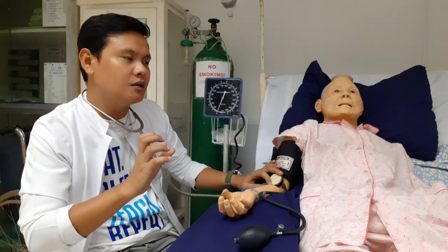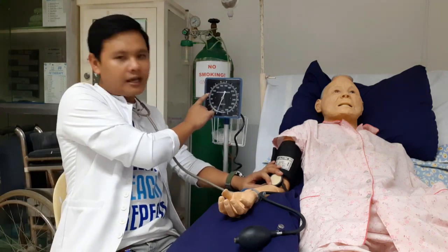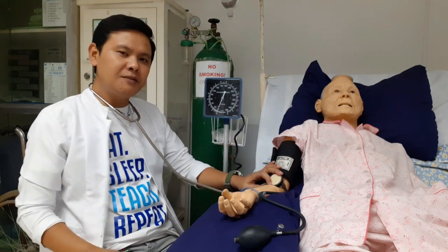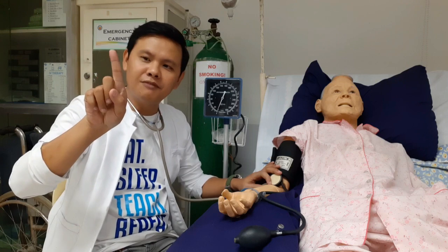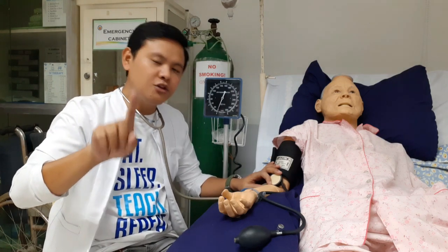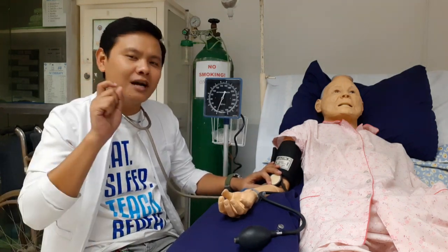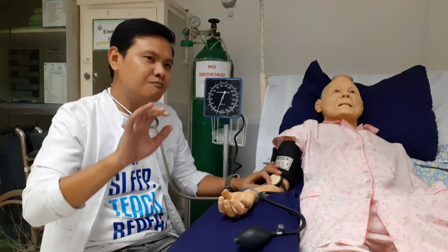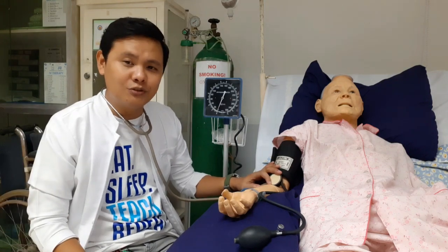Tapos, yung lowest sound, yung pinakamahinang sound, okay, ay narinig ko around 80. So, ang BP ng pasyente ko is 130 over 80. Tandaan natin, yung malakas na sound or usually the third fluctuation, kasi makikita mo, magpa-fluctuate yan. 1, 2, 3. Sa may pangatlo, doon mo marinig usually yung malakas na sound. That is the systolic. The diastolic is yung pinakamahinang sound. Okay, usually, fifth sound yan. Pero ang magandang indication dito is yung pinakamahina na sound na maririnig ninyo.